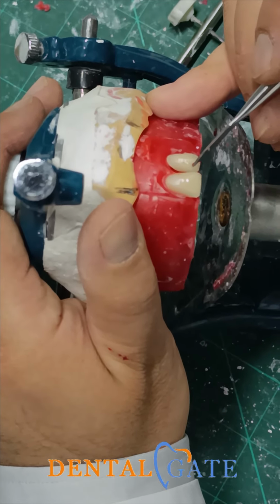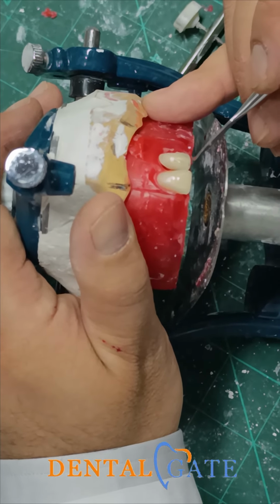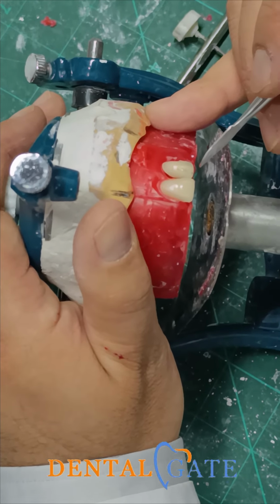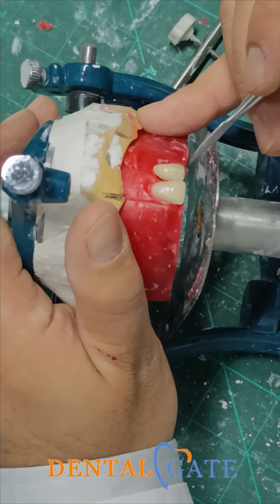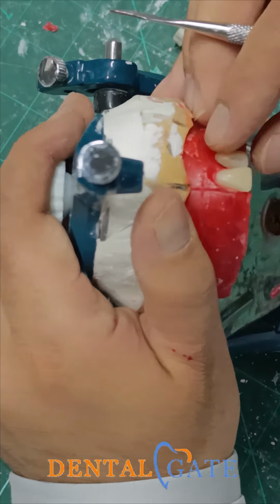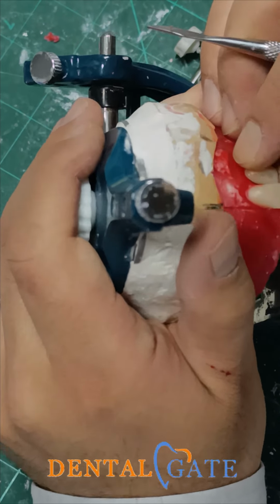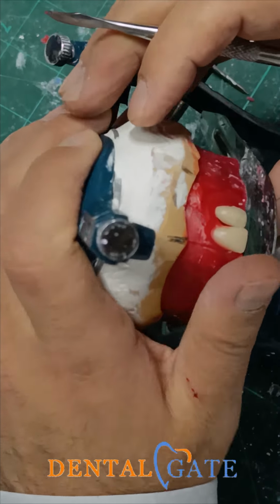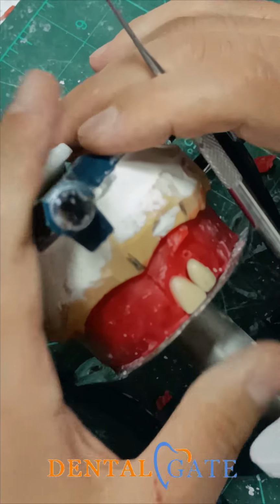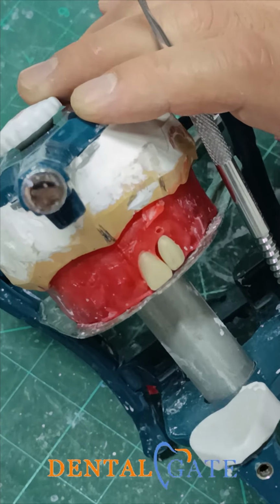But for the lateral incisor, the contact area, the maximum curvature, will be located there. We have a rounded shape in the lateral, so the maximum curvature will be located as well in the incisal third, but more towards the cervical. You can start with the contact area. If I make the contact area, we already have the space here, just 2 millimeters, okay, 0.5, or there is just no contact.